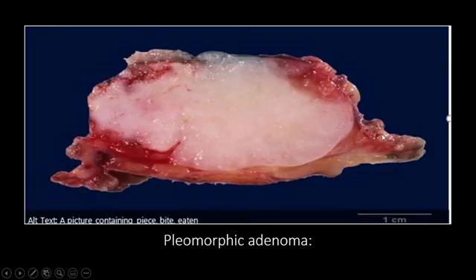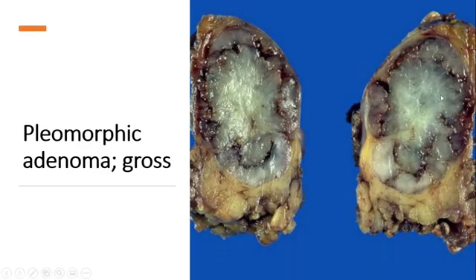However, the tumor is benign with no invasion, and the rate of malignancy is very rare, less than 1% after many years. Another gross cut section demonstrates the well-defined margins and intimate adherence of the tumor to the underlying soft tissue. That is why a good, wide resection margin is important to reduce the rate of recurrence.